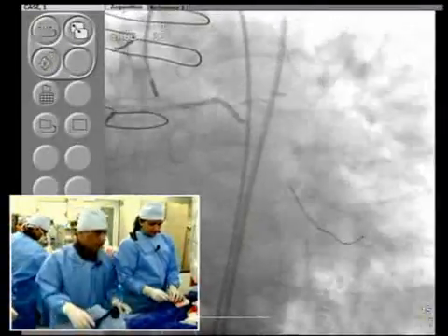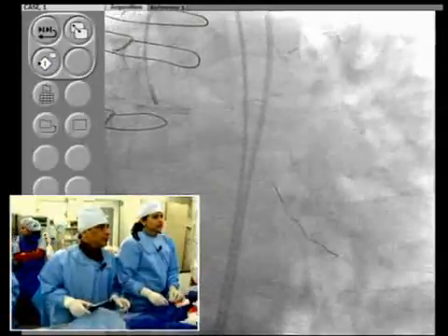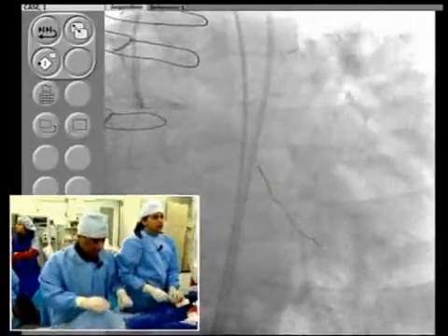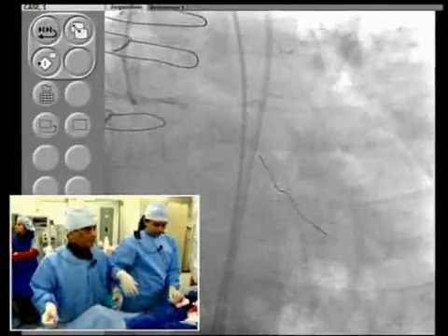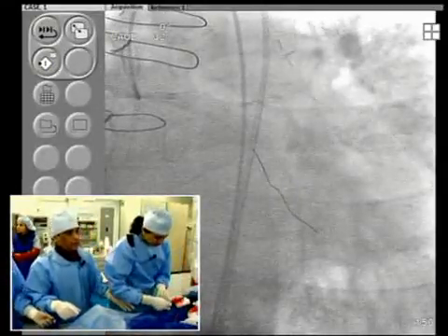Right now. No, but the wire has to go to the main wire. Why? It will stay there as long as you stop before the bifurcation. Okay, no? Take it off. Good. Now, this will be very tricky, that we need to stop it before the bifurcation.